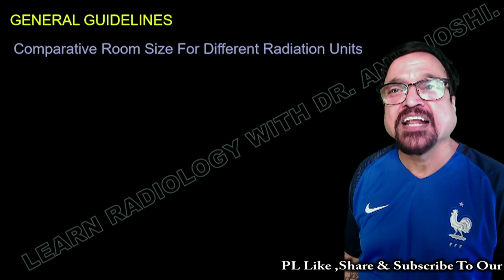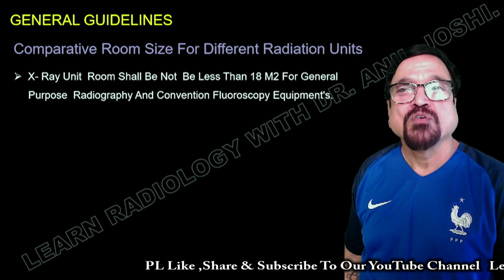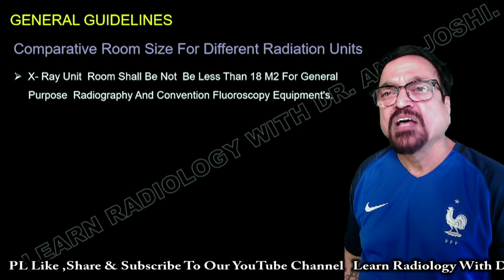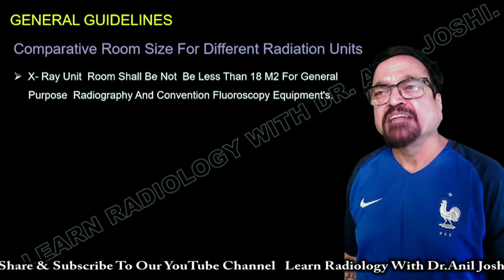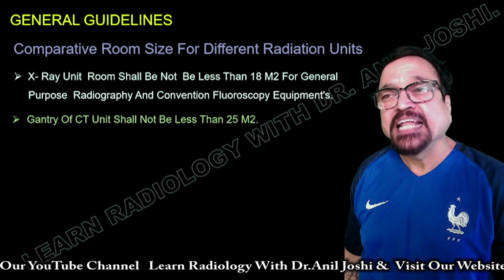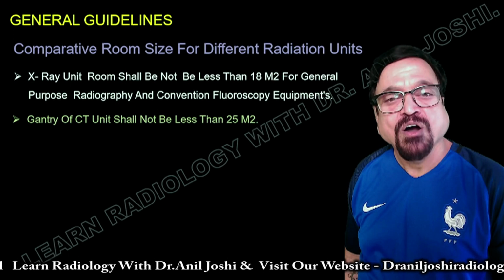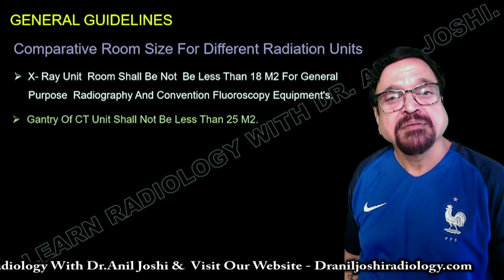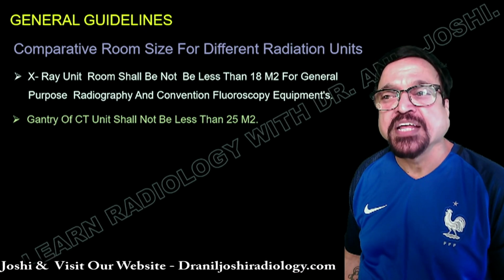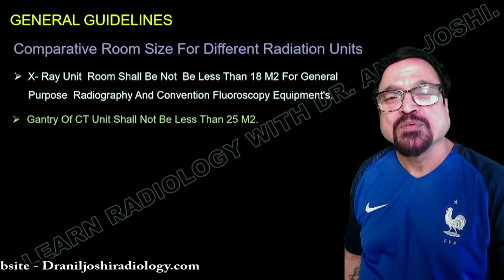Now what are the general guidelines? Room size for different radiation units is different. For an X-ray unit, for example, it shall not be less than 18 meters square for general purpose radiography and conventional fluoroscopy equipment. The gantry room of a CT unit shall not be less than 25 meters square. The only part of the CT unit which produces radiation is the gantry, so its room measurement is more than that of the X-ray room. X-ray room is 18 meters square, while the CT gantry room is 25 meters square.